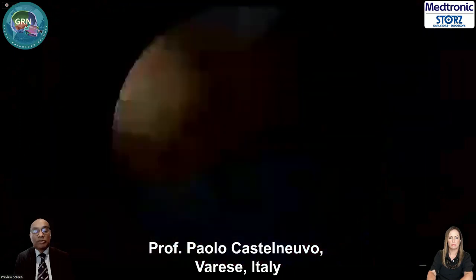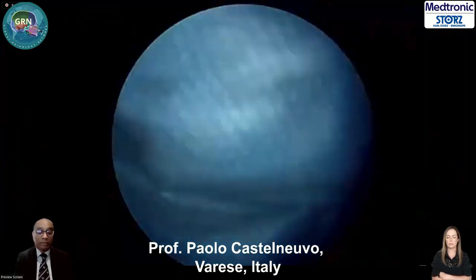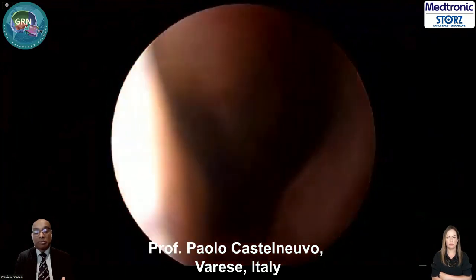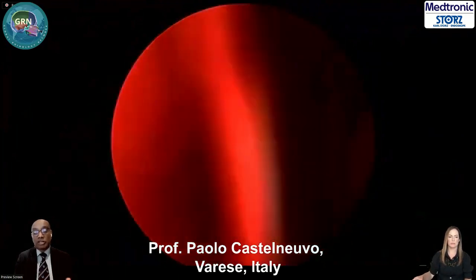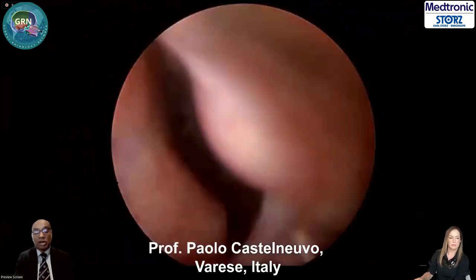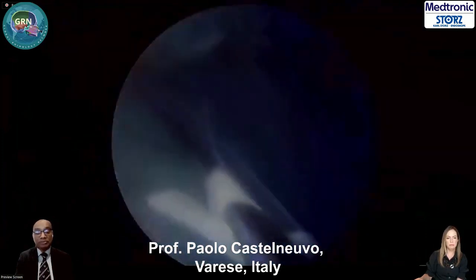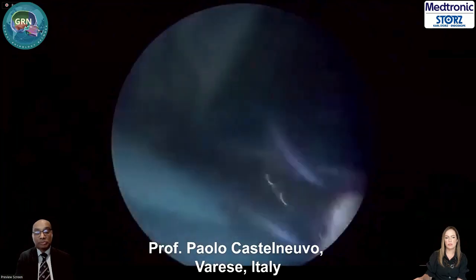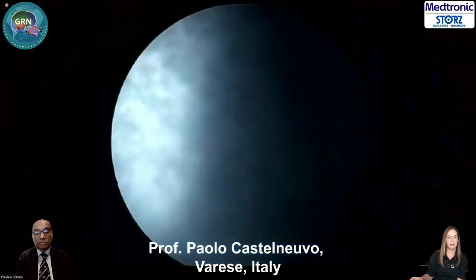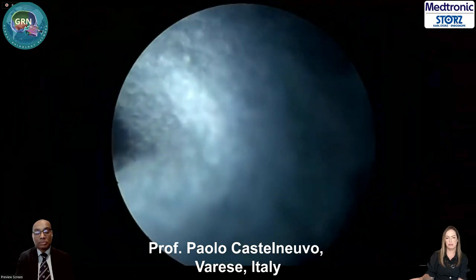Okay. It looks like a very functional operation, despite the very radical excision of the papilloma. You can see the lacrimal is preserved, then the inferior turbinate is almost in its position. So airway-wise, and with hardly any raw mucosal surfaces, the healing would be quite quicker as well. Do you agree with this? Absolutely. And when you compare it to a traditional medial maxillectomy, the healing is going to be much quicker, crusting is less, so much better for the patient.